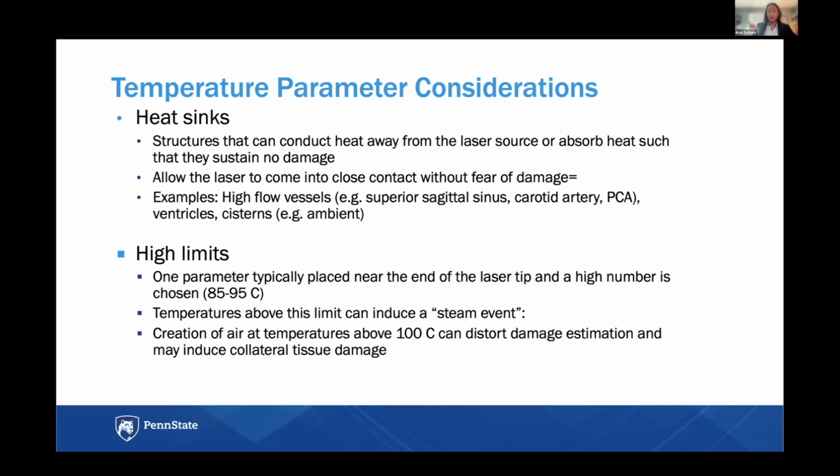You want to avoid any particularly high temperature at the laser tip. It's going to induce a steam event or boiling. And so there are ways to mitigate that as well.